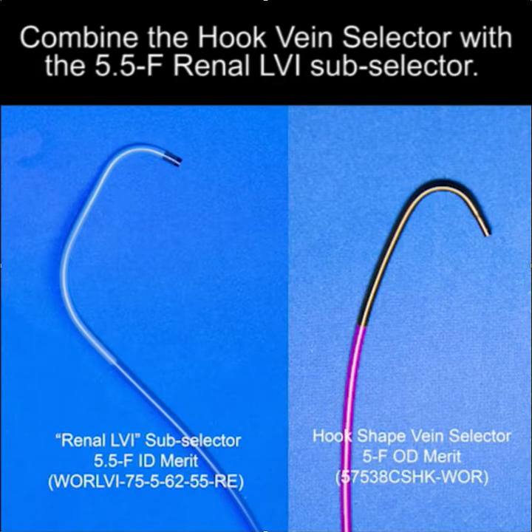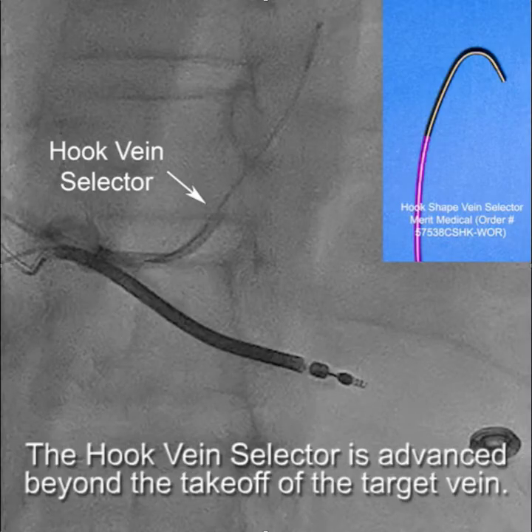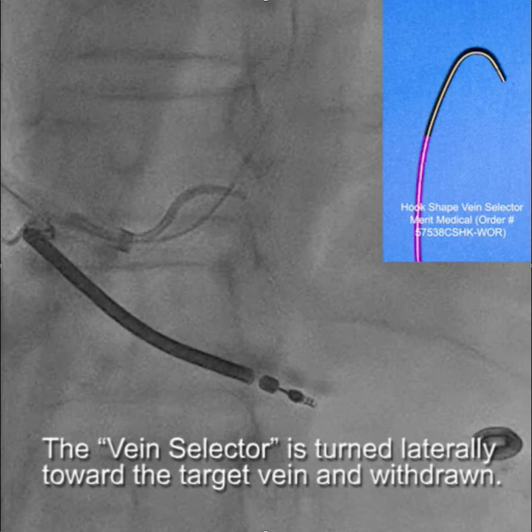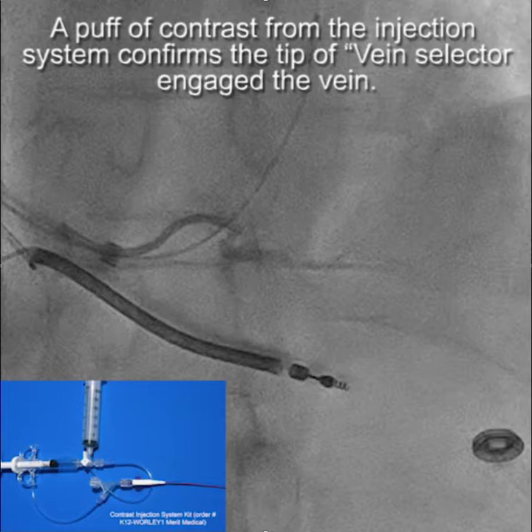We then combine the hook vein selector with a 5.5 renal subselector. Remember that vein selectors are not provided by the device company. The hook vein selector is advanced beyond the takeoff of the target vein. The vein selector is turned laterally towards the target vein and withdrawn.